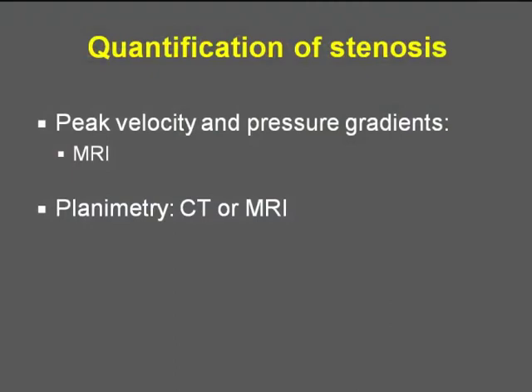On MRI, like I mentioned, you can do phase contrast imaging for quantification. If you do phase contrast imaging, you can compute the peak velocity, and you can get an estimate of the pressure gradient.